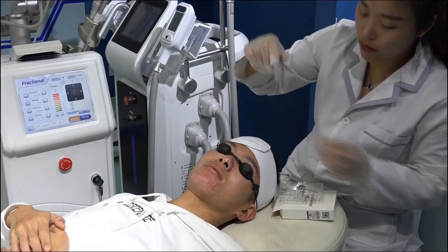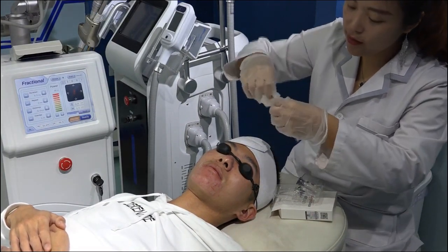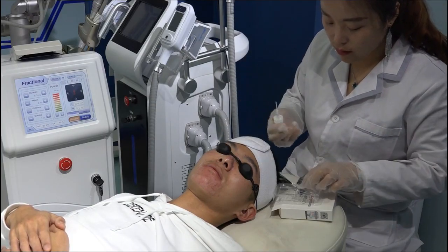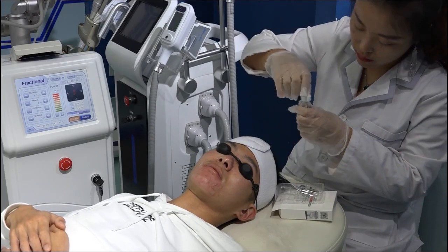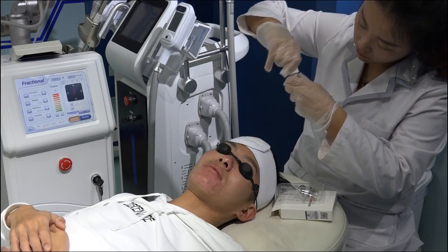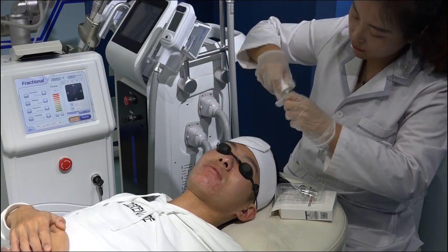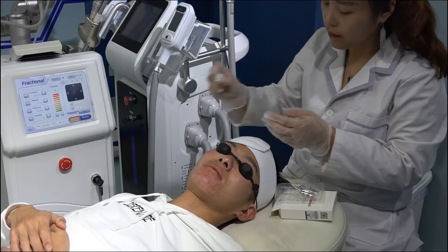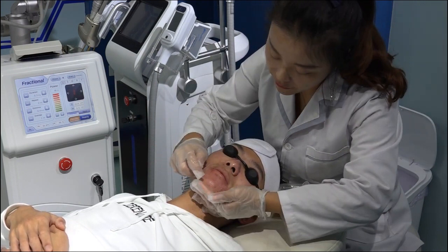Okay, this one. I will open it. Okay. Now we will apply on the face.